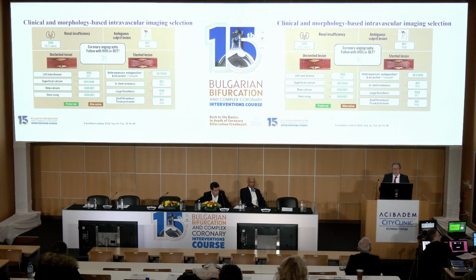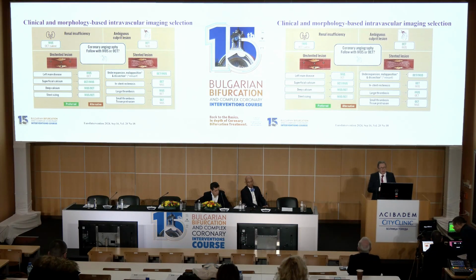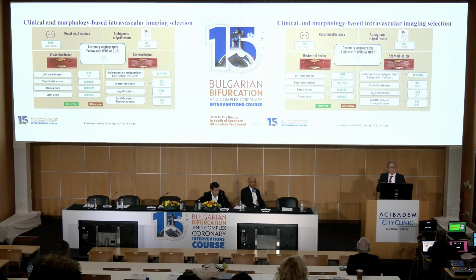So therefore, there are some proposals in the literature how we should manage and when and which kind of technique should be used for this IVUS diagnosis, for left main disease diagnosis and treatment.